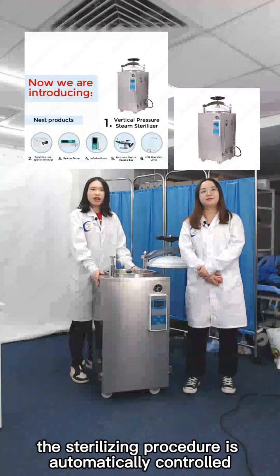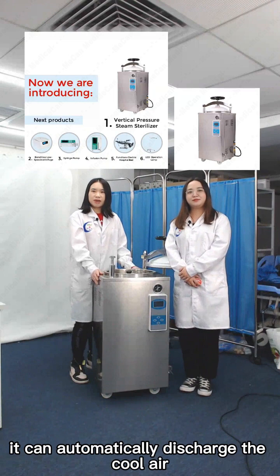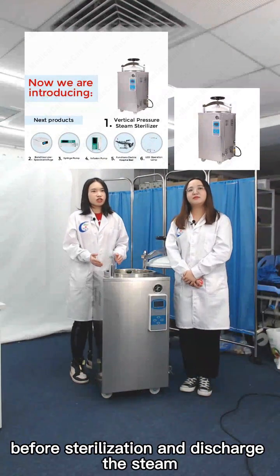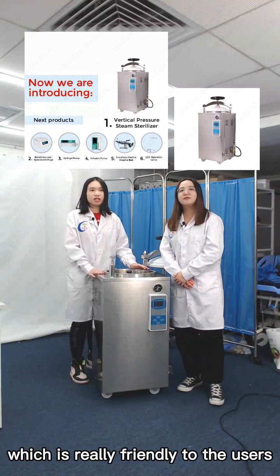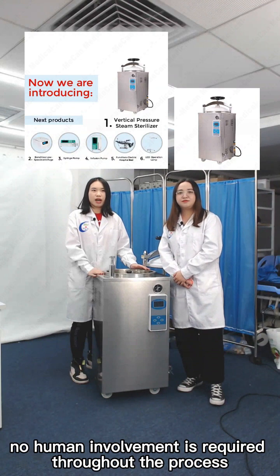For this model, the sterilizing procedure is automatically controlled. It can automatically discharge the cold air before sterilization and discharge the steam after sterilization, which is really friendly to users. No human involvement is required throughout the process.